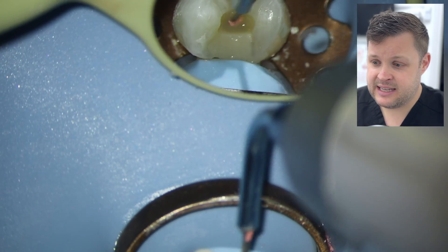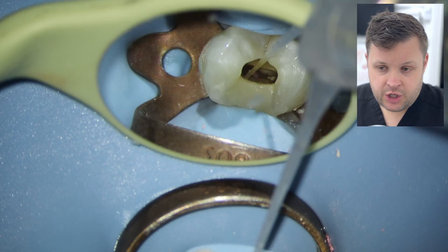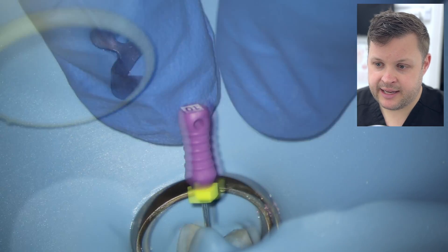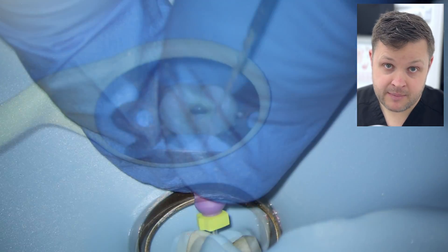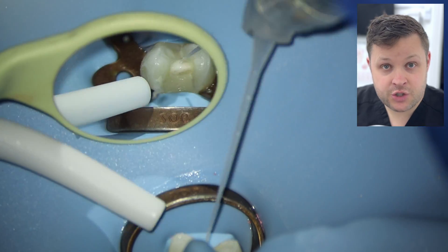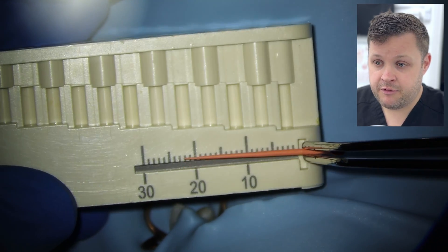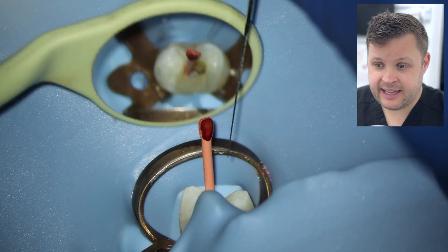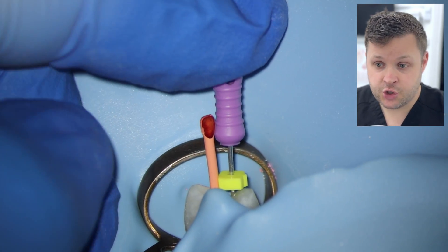Irrigating the palatal canal and activating it, I can see tiny fragments remaining. I'm using a size 10 K-file to recapitulate the buccal canal — I want to make sure I'm still patent, because removing GP from one canal can block the other. I want to check confluence: how and where the two canals join. The working length of the buccal canal is 23mm. I'm fitting a GP point to length, then placing a K-file in the palatal canal and marking the rubber stopper to identify where the join is.